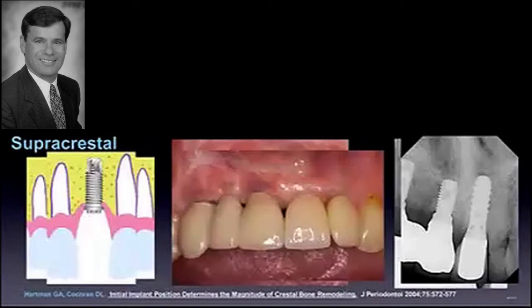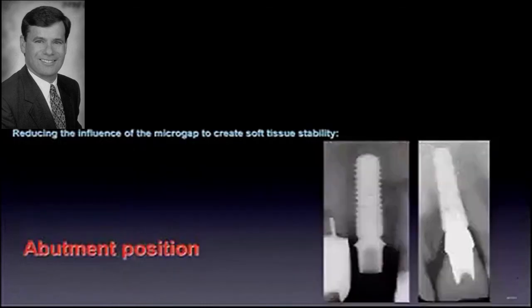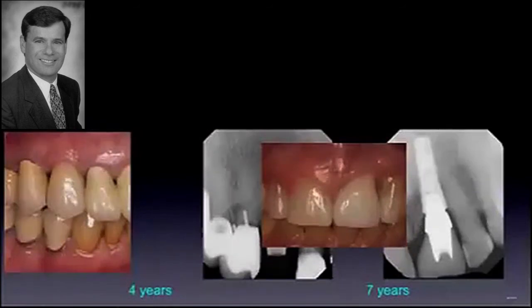So the abutment position could also be where you place. Even a good abutment implant connection, if placed in the wrong spot, could be a problem. So I inherited this patient over here, which had an Astra implant placed years ago, 7 years ago, and it was placed in a subcrestal position. Now, this is an excellent implant with an excellent abutment implant connection, but when it's placed significantly subcrestally, not by design, by its original design, you could end up with trouble.